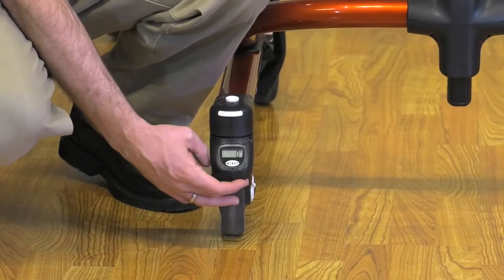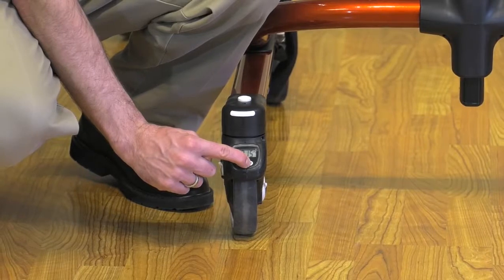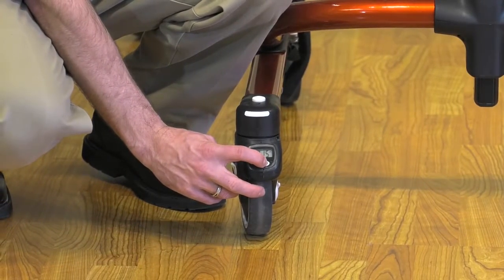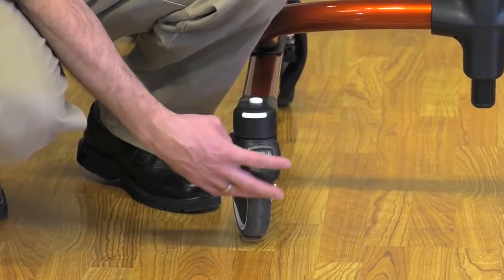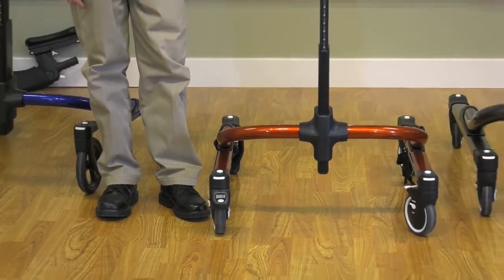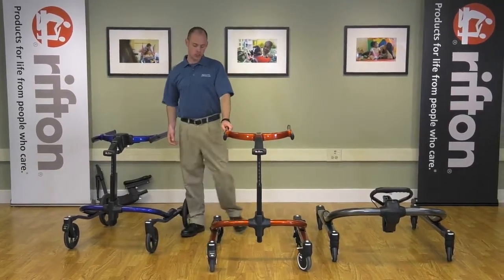If you would like to see the total distance the Pacer has traveled, you just hold the reset button down for 3 seconds or so, or even a little less, and it'll tell you in thousands of feet. So that one there was 15,000 feet. The number is 15. That means 15,000 feet is the distance that this Pacer has traveled altogether. If you'd like to switch to meters, you just have to hold the reset button down for 10 seconds or so, and that'll switch to meters, if meters are more helpful to your counting. So that's a great new feature.